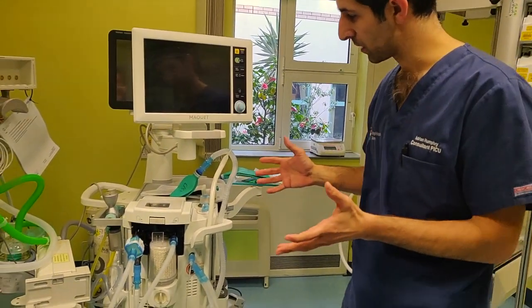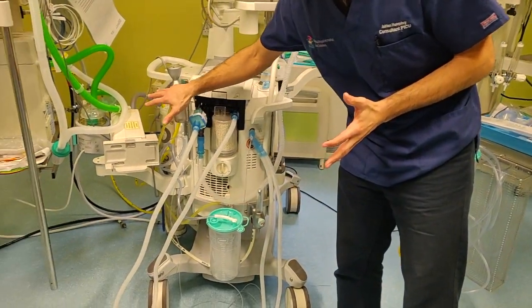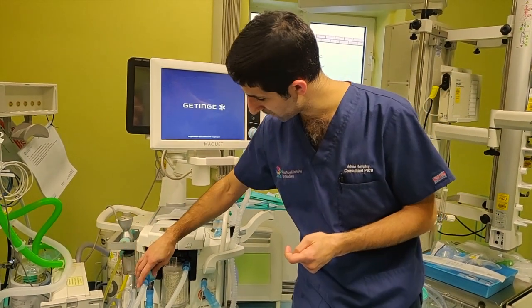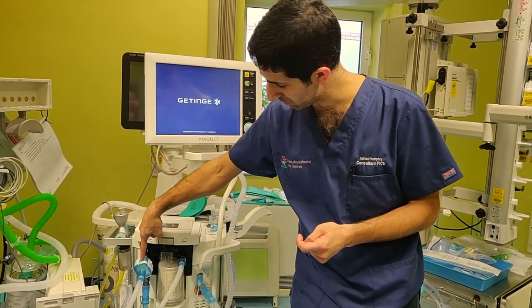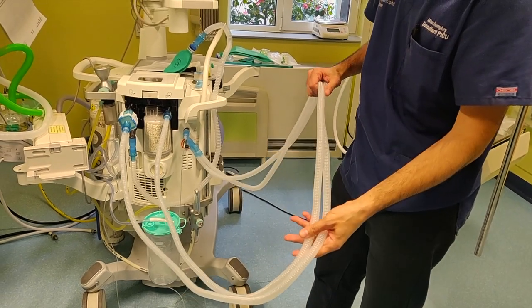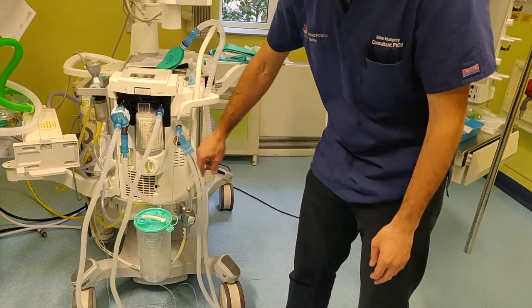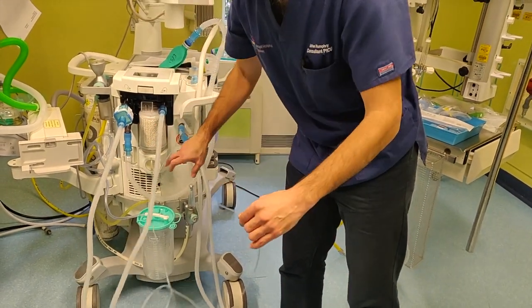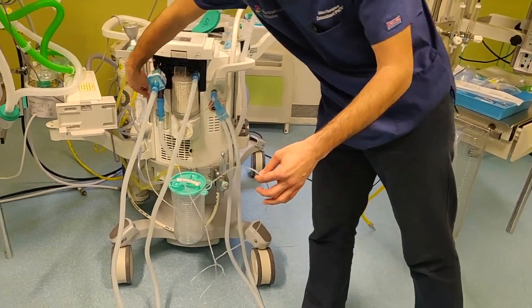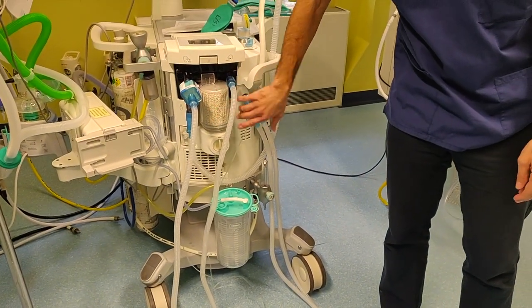A few things to check before you get going. If you are going to use suction on here, you clearly want a suction unit set up and attached. It's fairly straightforward if you've used wall suction. Your circuit — we've got a bacterial viral filter in here, a non-complicated dual limb circuit, which sits onto there for the time being. And then all your gases circuit, the monitoring comes off there and fits onto a little water trap that sits on the side.